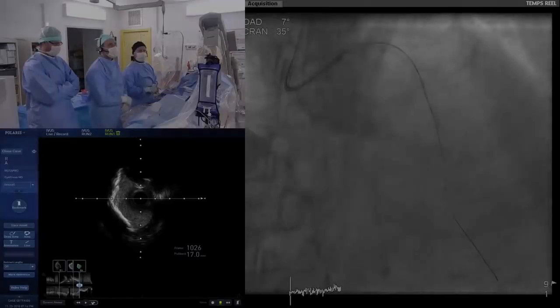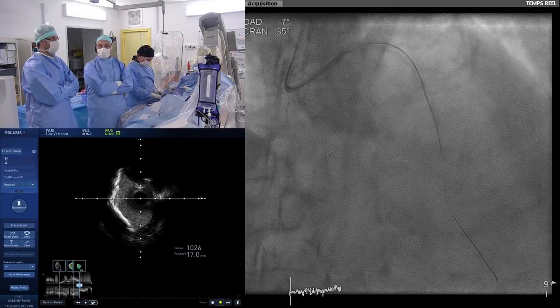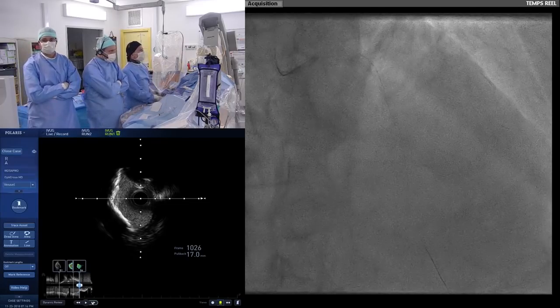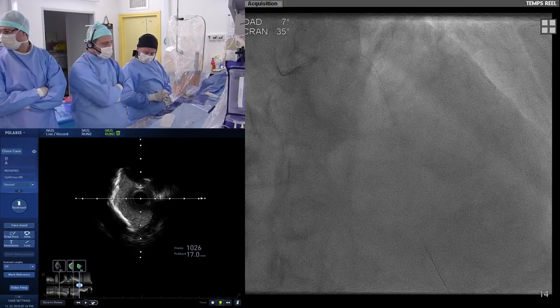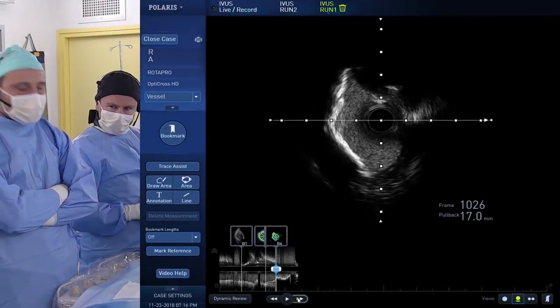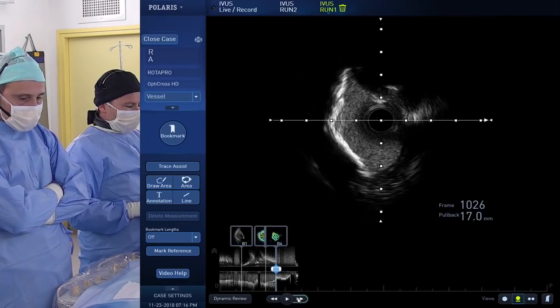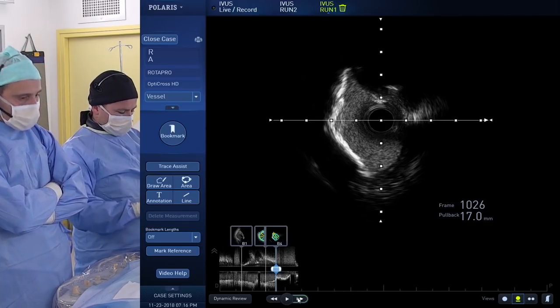The new surprise is effectively the ostial calcified nodule on the ostial part of the left main. When you look at the IVUS, is your decision modified concerning the left main? What do you think? Do you think it's important to stent the left main or not?